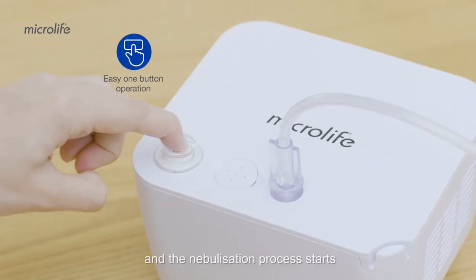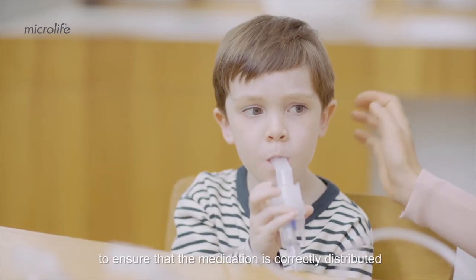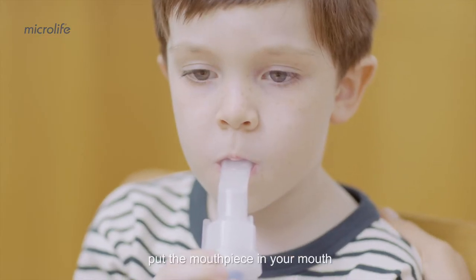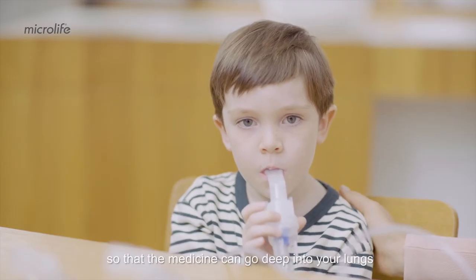Press the power switch and the nebulization process starts. Sit upright and hold the nebulizer straight to ensure that the medication is correctly distributed. Put the mouthpiece in your mouth and close your lips tightly around it. Breathe normally through your mouth so that the medicine can go deep into your lungs.